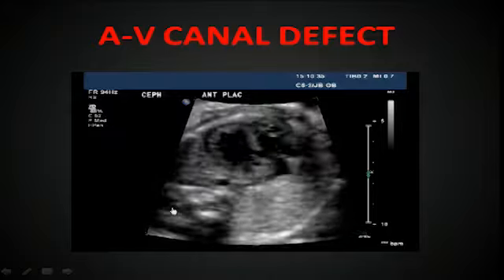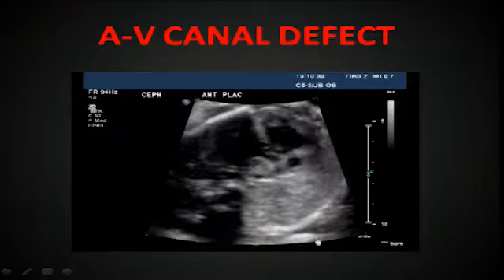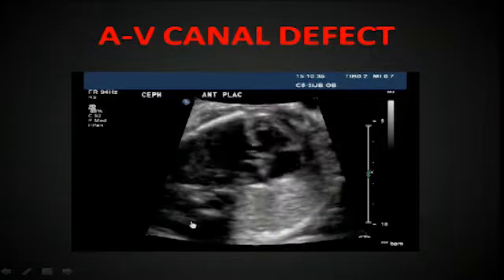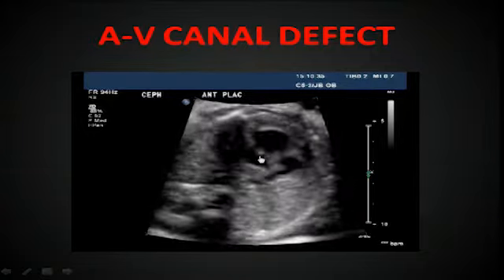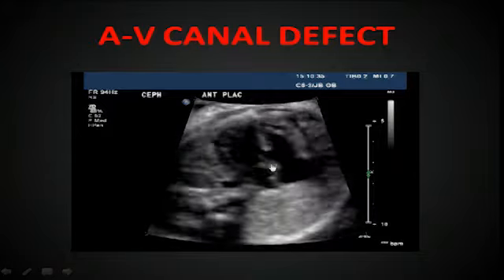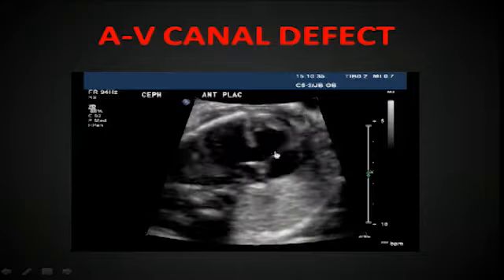So we see the spine here, anterior wall. This is going to be the left wall and then the right. So here's the spine, apex over towards the left. But you can see, look at those little bright areas. They're just telling you, look at my septum, look at my septum. It's attracting your eye to that area of the septum here.